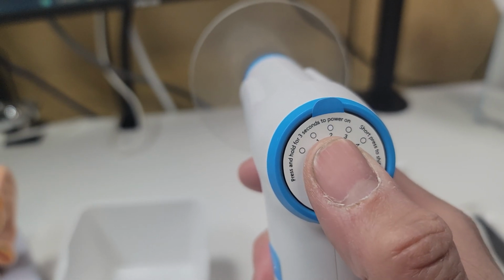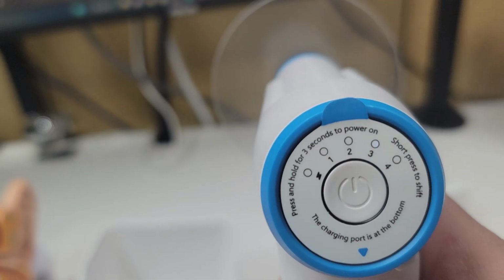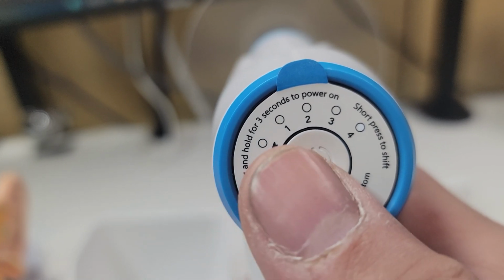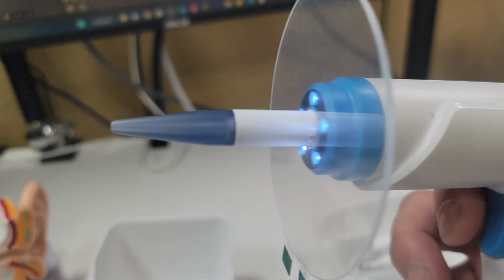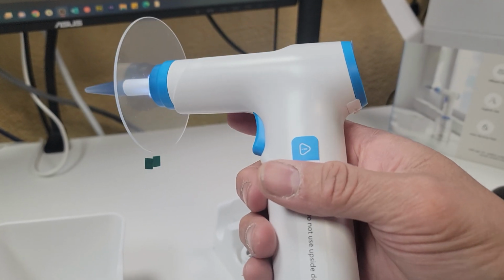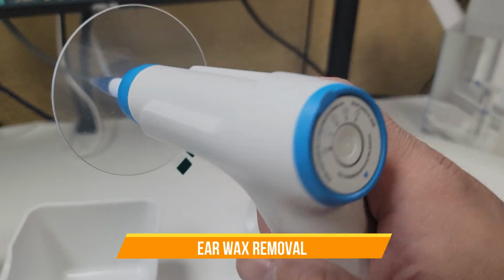And if you click on this, number 2, and this is a different mode. If you can hear, number 3, number 4, and back to normal. And then we just click on it once and that's it. To turn off the light, turn off the power too. So we're going to test out the different modes. We're going to test out 1, 2, or 3 different modes. So let's go ahead and do that.